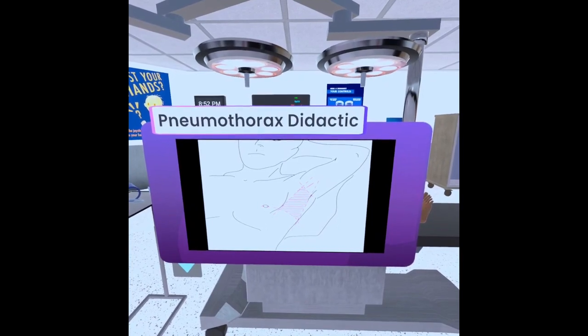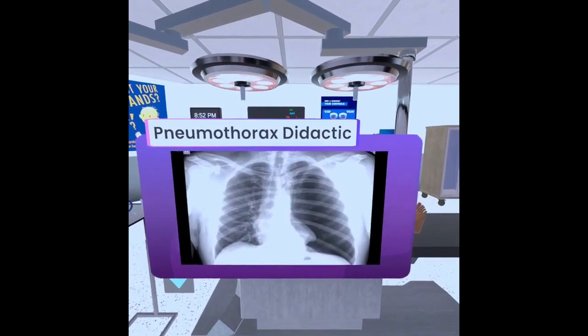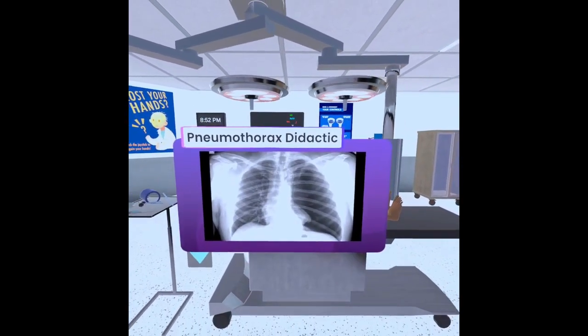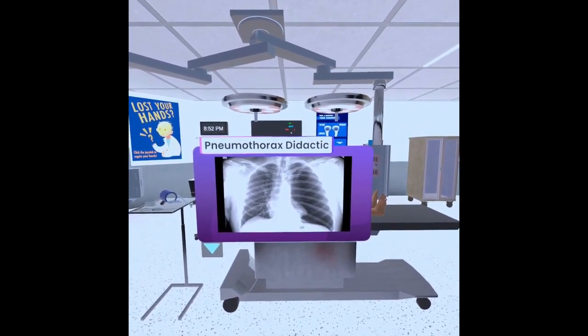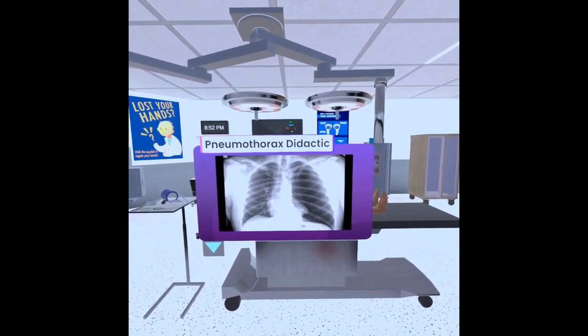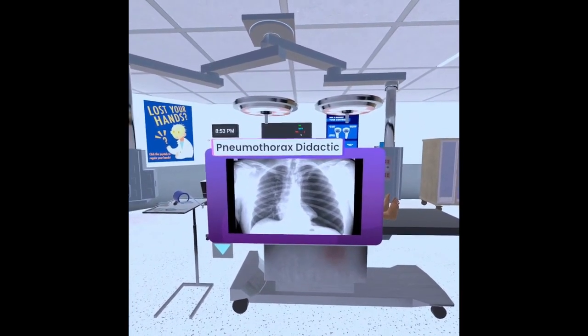Many clinicians do get a chest x-ray to confirm a pneumothorax before doing any intervention, but really if the patient is not doing well and you have a clinical suspicion for pneumothorax, you should go ahead and treat. You can always get a chest x-ray afterwards. This goes over the basics of how to work up and treat a pneumothorax in a very conservative fashion.